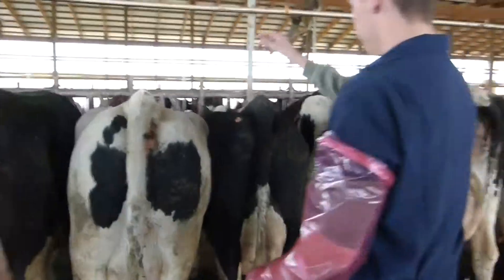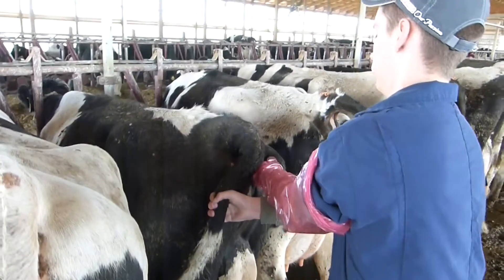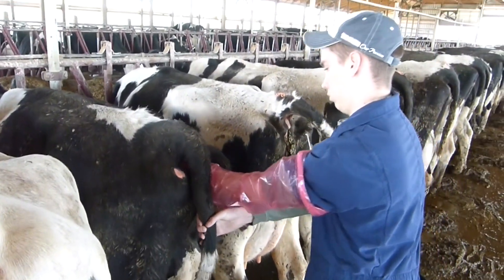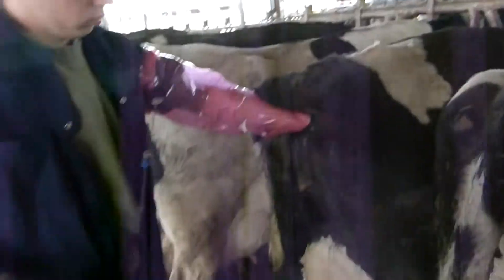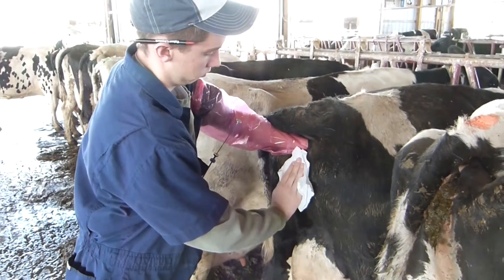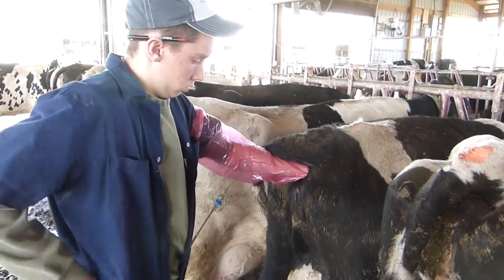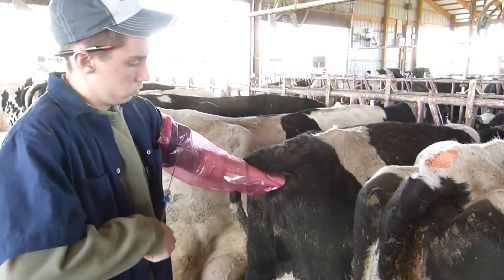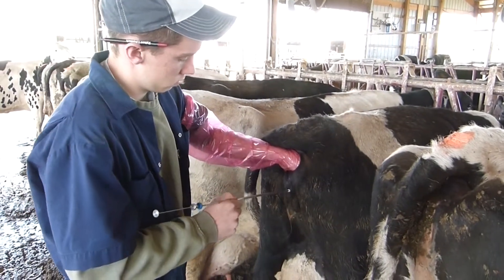I locate the cow that is in heat. I take the hand that is covered in the plastic sleeve and enter the rectum. I then take the paper towel out of my pocket and wipe off the surface of the vagina. Once it's all wiped off I remove the gun from my pocket, open the surface of the vagina and place the gun inside.